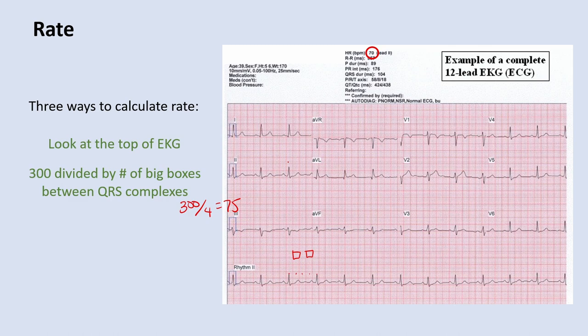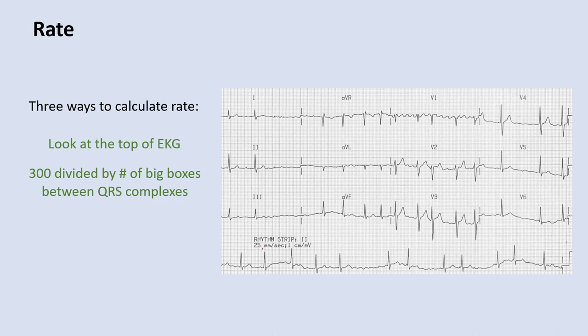Sometimes you have an irregular heartbeat and you can't accurately count big boxes between QRS complexes. So instead, you count every single QRS complex on the rhythm strip — five, six, seven, eight, nine, ten, eleven, twelve — and multiply by six, because the rhythm strip is 10 seconds long. That gives you an approximate heart rate of 12 times 6, or 72 beats per minute. Count QRS complexes in the rhythm strip, usually lead two, and multiply by six.